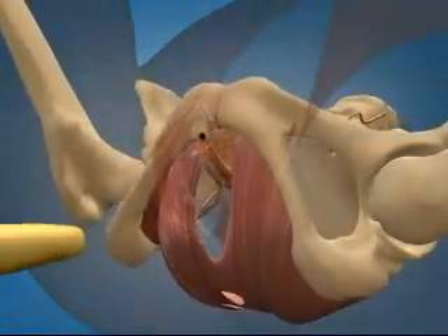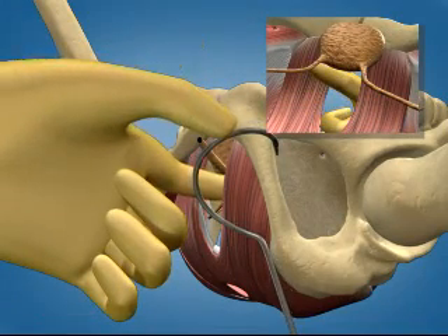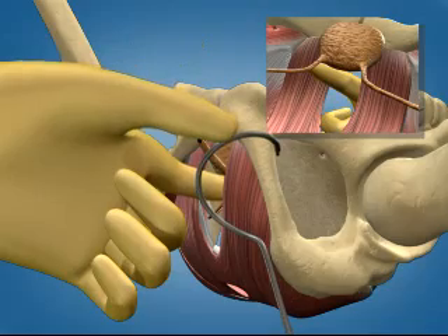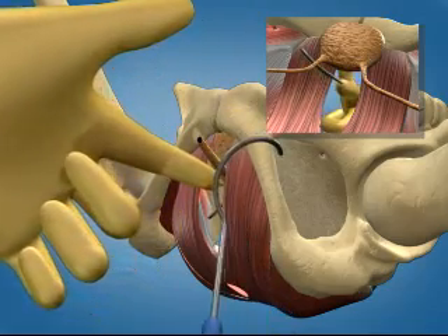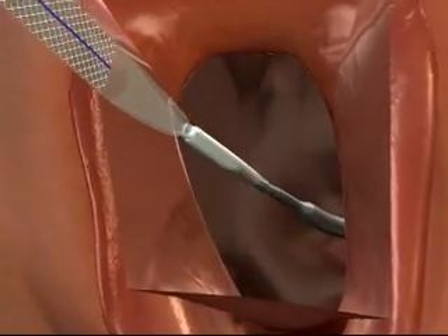With the device for the patient's left side in your right hand, insert the left index finger so the fingertip is behind the bone. Holding the needle at a 45-degree angle, push the needle tip through the left skin incision and onto your fingertip. Rotate the needle tip onto your fingertip and toward the vaginal incision.